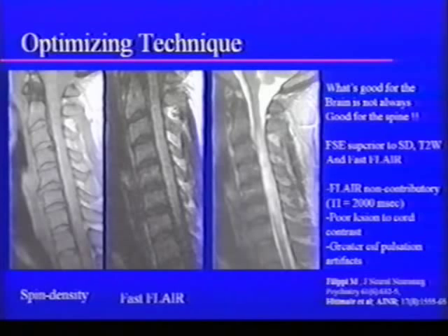So here's the spinal cord. And although I'm probably the only neuroradiologist in the room, all you need to know is that focal bright in the cord is bad. Okay? So I would ask you to say, do you see a transition here on this spin density image? I think you'd say the answer is no.